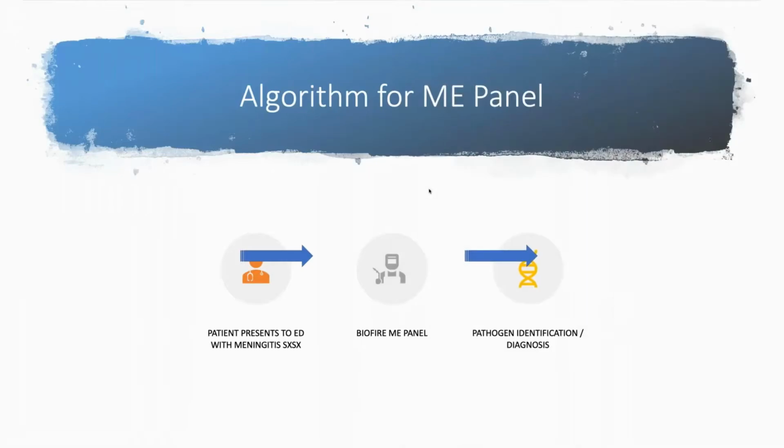Okay, so here is the algorithm, right? A rather complex algorithm, and I do apologize that the arrows got a little bit offline there. Here is the complex algorithm that we developed. Patient comes into the emergency room. You think they have meningitis, you get a lumbar puncture that goes straight to BioFire, and then we do pathogen identification. We kept it really simple, right? But we also said, listen, you do an LP, it's going through the ME panel with BioFire, right? That was a straightforward algorithm that we set up.